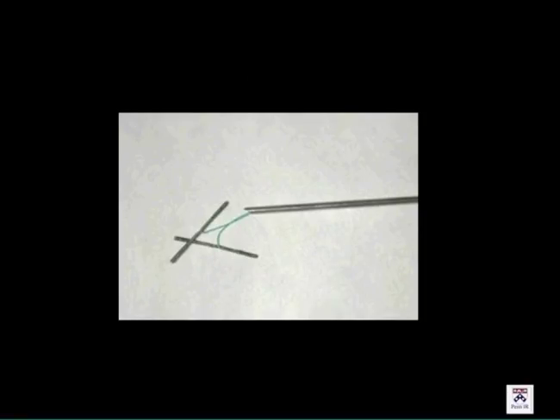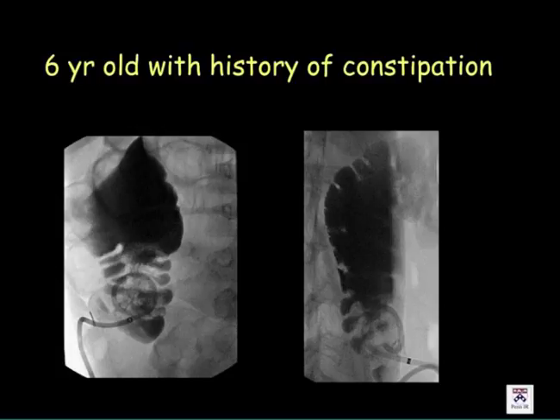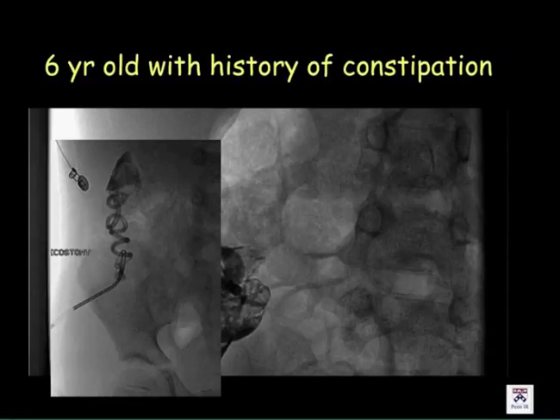So how do you do this cecostomy? First, you put the anchors, secure the cecum to the abdominal wall, put your pigtail catheter, and make sure that the tract matures. After the tract matures, about 6 weeks, you bring the patient back and put in this cecostomy catheter, and immediately after, the patient can start using it. Usually they attach this flushing device to the cecostomy catheter and flush the colon. Yeah, that's pretty much it.